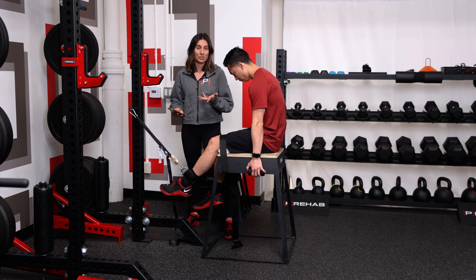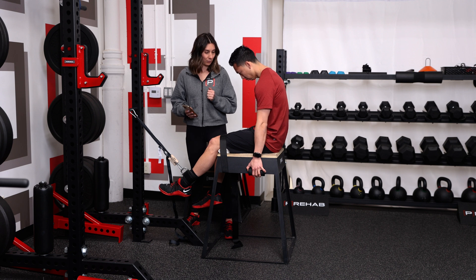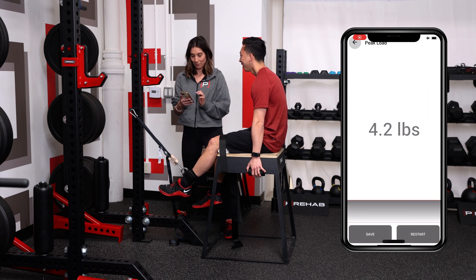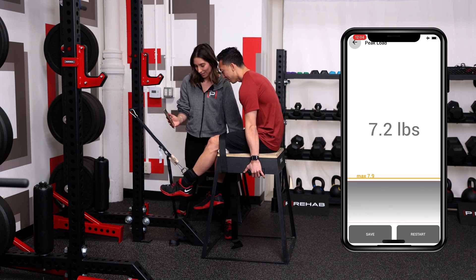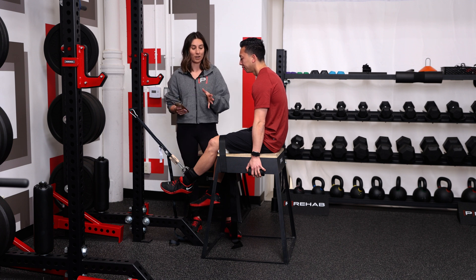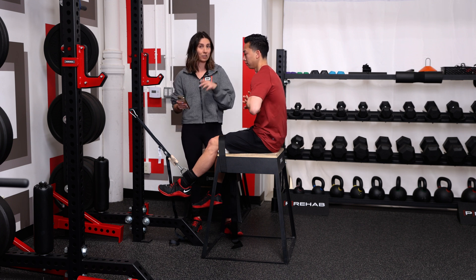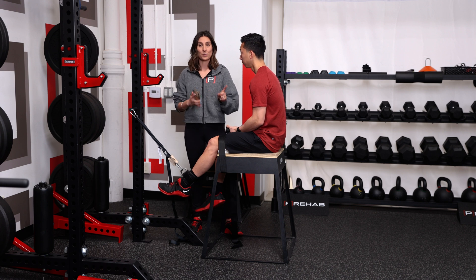When going into these tests, also think about the cues you're using — every person is a little different. Do they want to pull? Push? Drive their heel back? Play around with your cues across trials. On the count of three, two, and pull — rest. The hamstring number is not going to be as high as the quads. Hamstrings have a certain ratio we'd expect, usually about two-thirds of your quad strength, so we're not looking for a one-to-one ratio here. But more importantly than normative data, you're going to be comparing side to side. Let's move on to 90 degrees.